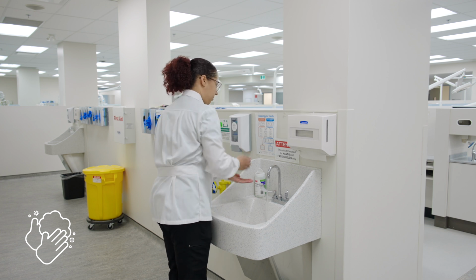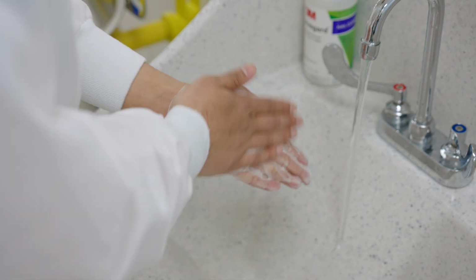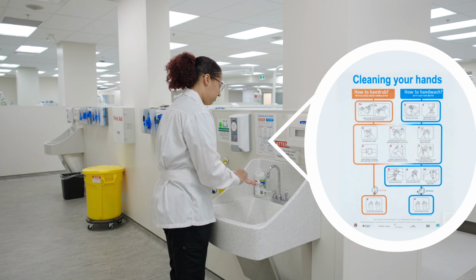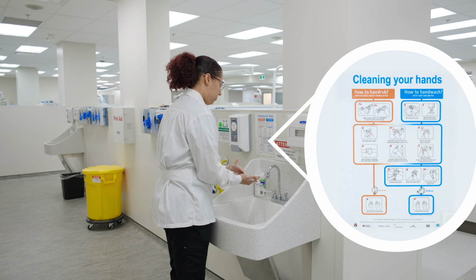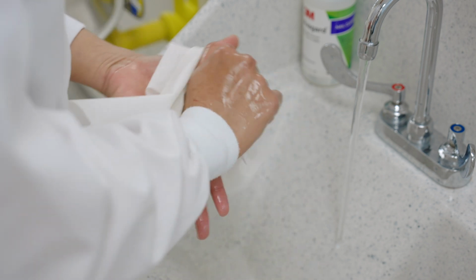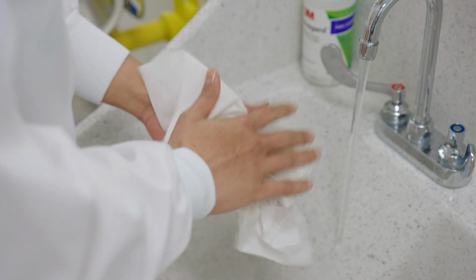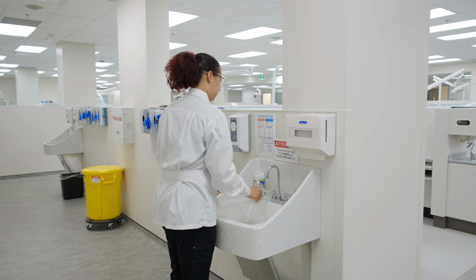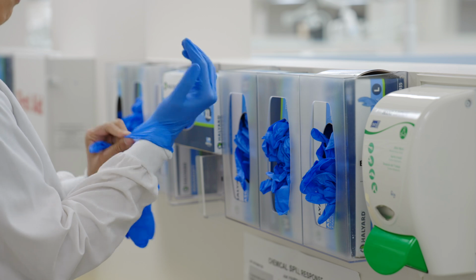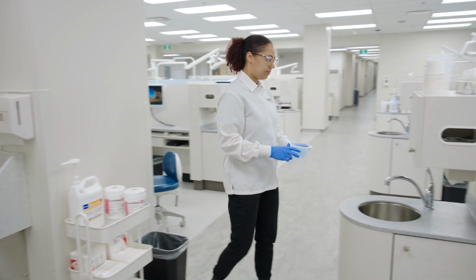Hand hygiene is performed at one of the designated hand washing stations using soap and water. Ensure to follow the steps given on the hand hygiene poster located above the sinks. Hand hygiene is the most effective measure for preventing the transmission of pathogens and the most cost-effective. After performing hand hygiene, dry your hands using paper towel and then use the paper towel to turn off the tap. After performing hand hygiene, don gloves and begin the process of cleaning the high and low volume suction lines.